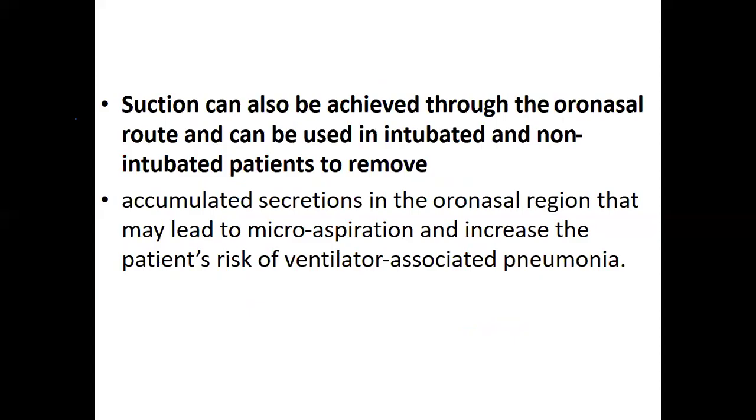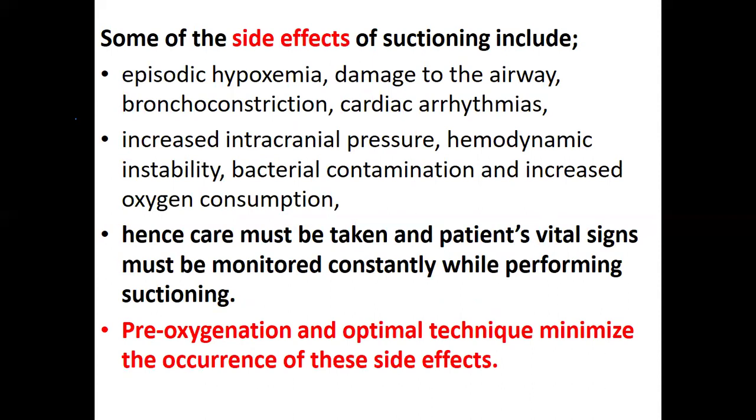It can also be achieved through the oral nasal route and can be used in intubated and non-intubated patients to remove accumulated secretions in the oral nasal region that may lead to micro aspirations and increase the patient's risk of ventilator-associated pneumonia.